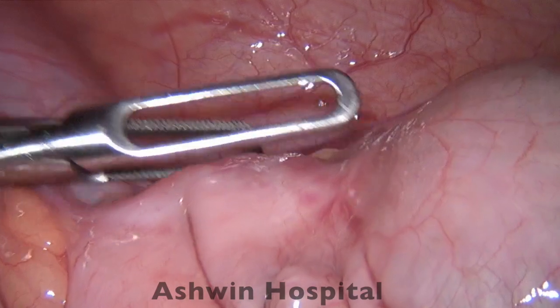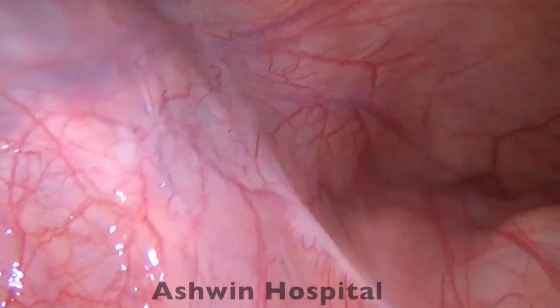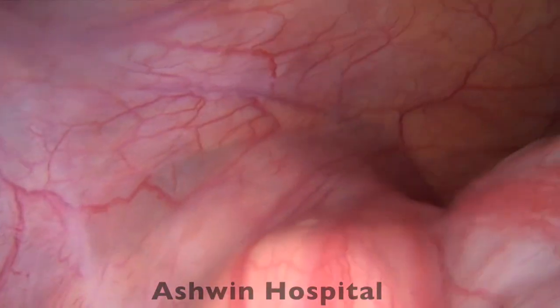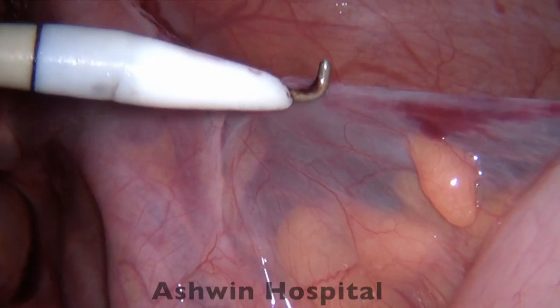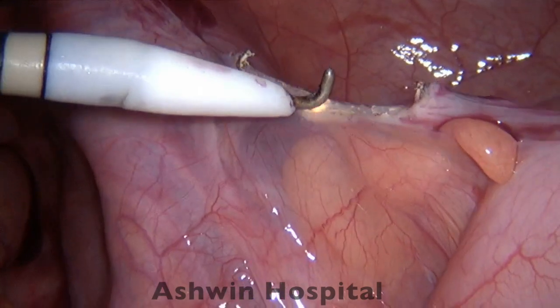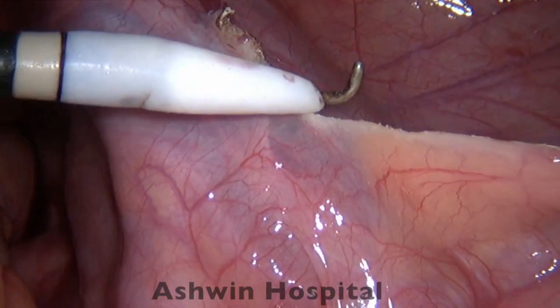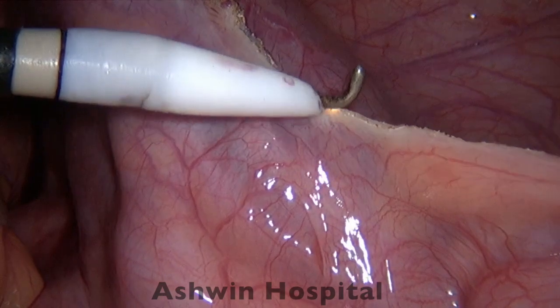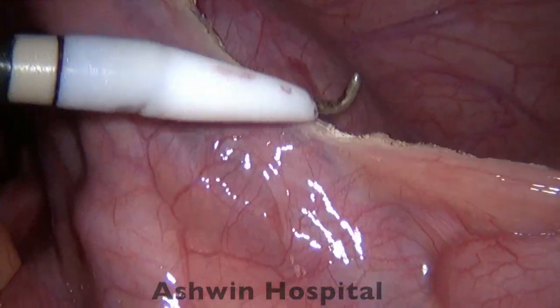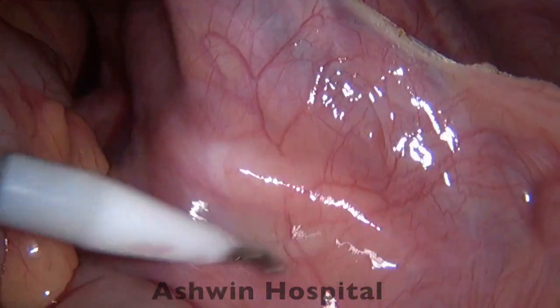This video demonstrates our technique of performing a laparoscopic appendectomy for a patient with acute appendicitis. The appendix was retrocecal in position — we are not able to identify the appendix clearly. Whenever there is a retrocecal position, we would generally mobilize the cecum so that we can rotate it and see the appendix more clearly.